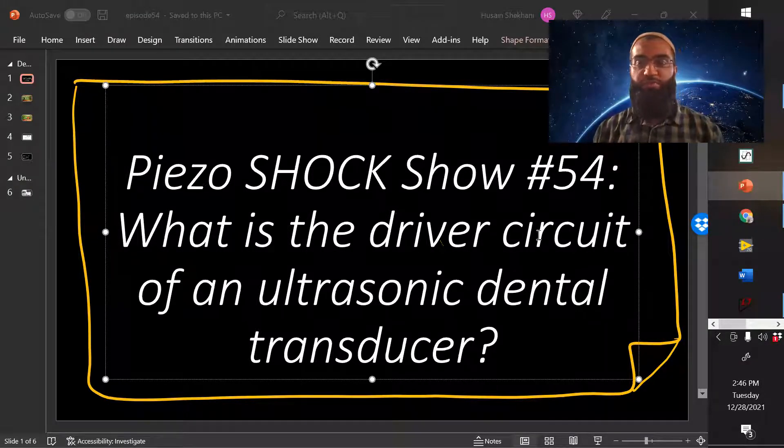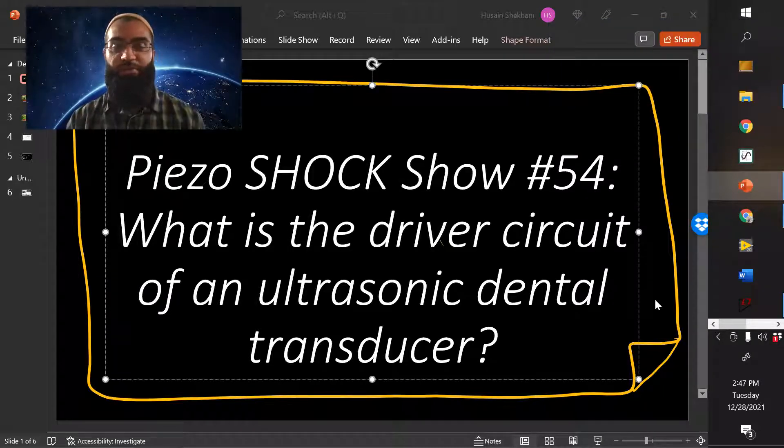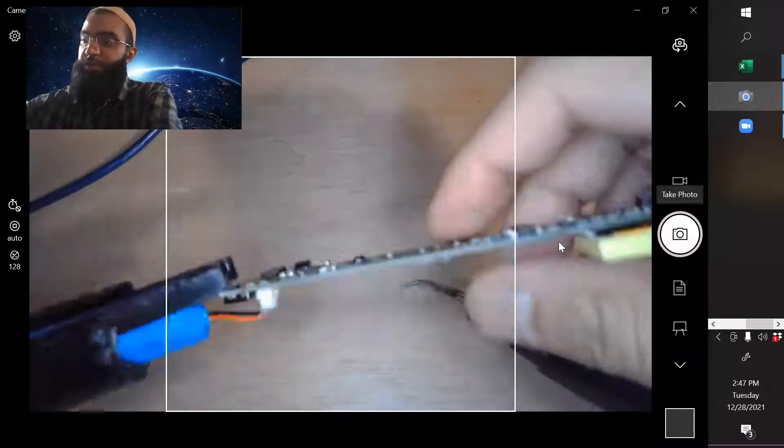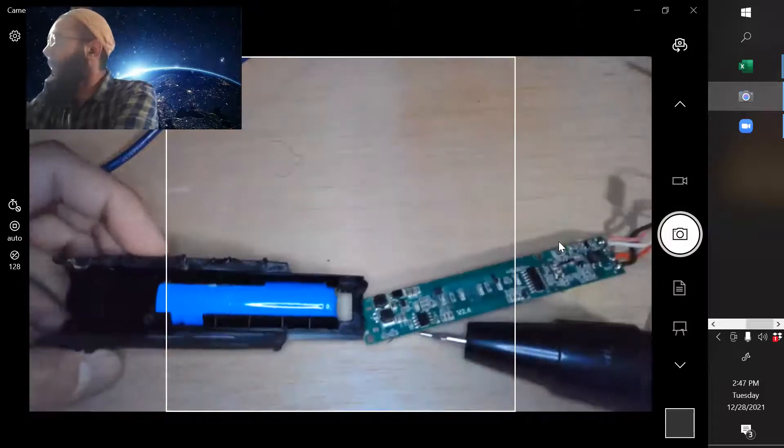All right, welcome to episode number 54. Today I'm going to be showing you the driving circuit of that ultrasonic dental transducer, which I purchased quite inexpensively — about 40 bucks — and it includes the transducer, the driver circuit, the battery. Everything is made to be cost effective, which makes for a very interesting understanding of the design. It's obviously a low power device. So I'm going to show you what I did here and how the circuit was actually all connected.